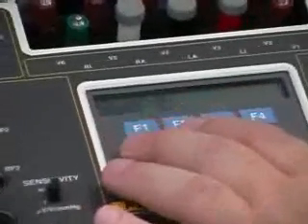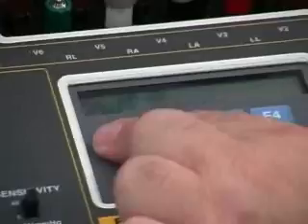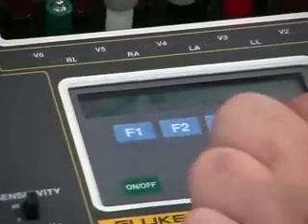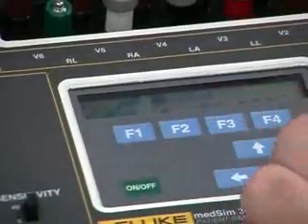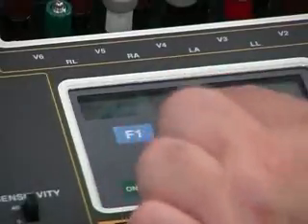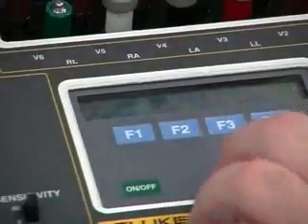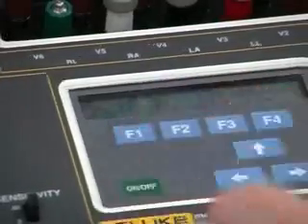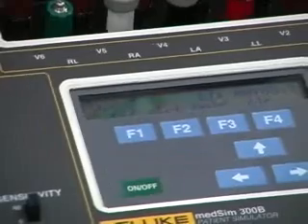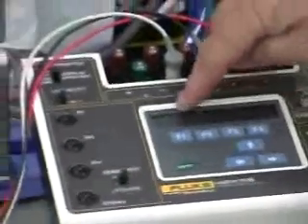You can look at the interval of the coupling from the previous normal beat. How many happen per minute? So you can bring that up to 24. And at the end of it, there's your little elapsed counter. So you can say how long the test is run and how many PVCs have occurred.